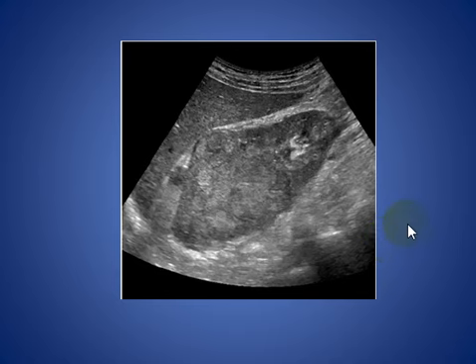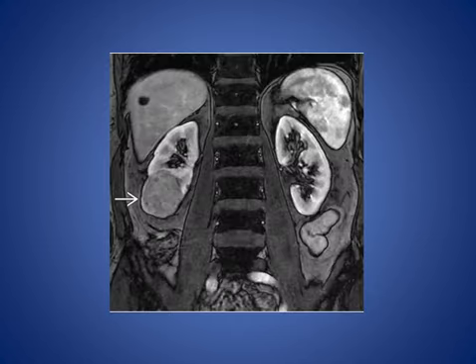Here, this is ultrasound of a patient with mass involving the right mid, above, and mid pole of the kidney. It is echogenic and patient has hematuria. And in the CT scan, not shown, this patient has involvement of the renal vein, indicating stage 3 renal cell carcinoma, confirmed with CT and nephrectomy.